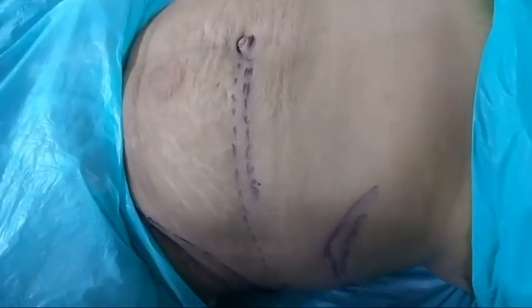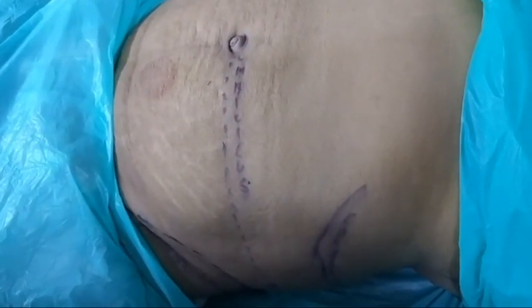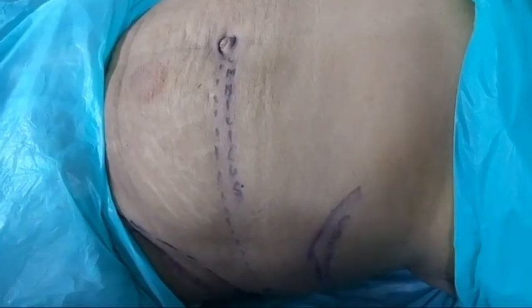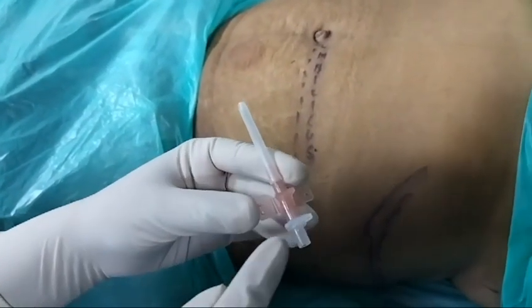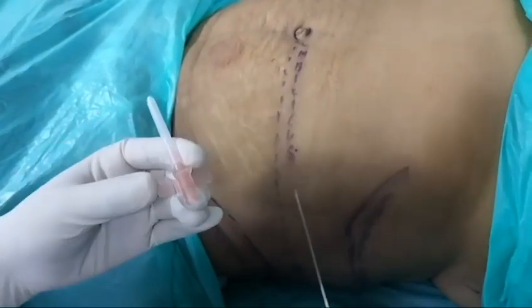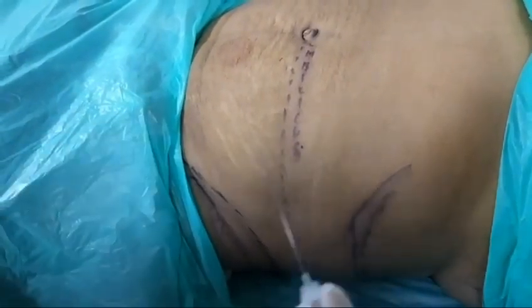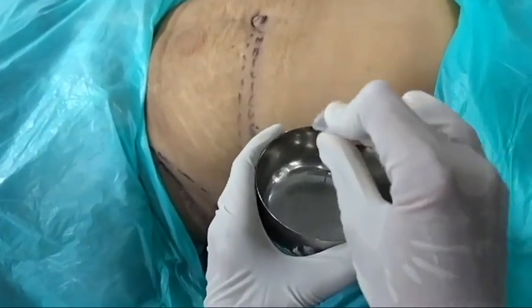The patient has now been intubated, and under all aseptic precautions we have painted and draped the patient with betadine and spirit, and the landmarks have been marked. As the patient is obese, for this patient we will be using a 20 gauge Gelco. We remove the stylet and we use the stylet as the block needle. Before giving the block, we are going to blunt the tip of the needle.